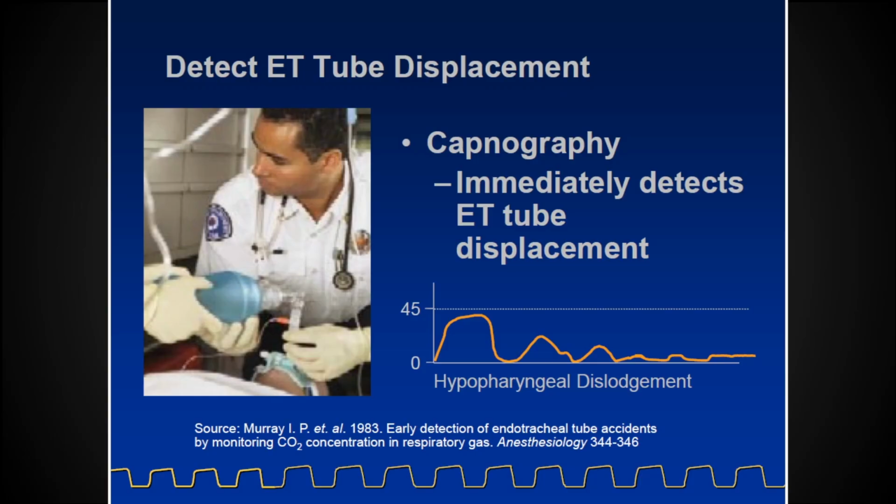This one perhaps should be obvious, but again, this comes down to what do I want you to do if you're bagging a person you just put an iGel into and you start to see this happen? Check the equipment. Reassess, ABCs, look, listen, feel, right? Absolutely.